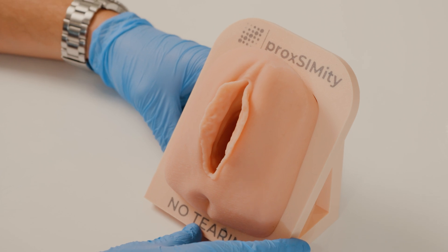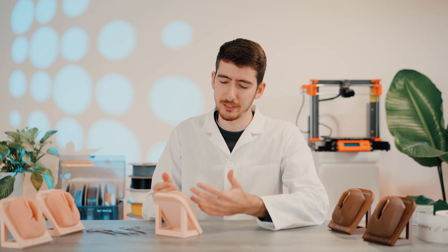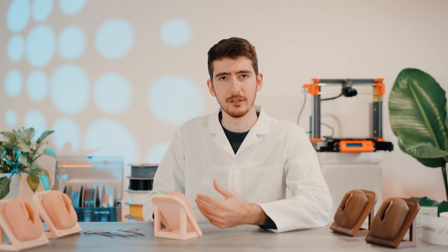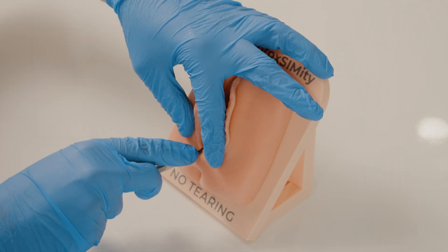First, position the simulator as the patient would be positioned during childbirth. Next, look at the anatomical landmarks and decide where you are going to be making an incision. After that, you can grab a scalpel or scissors and perform the incision.